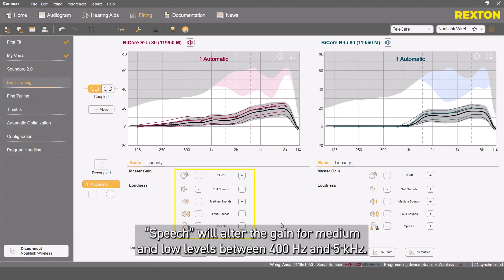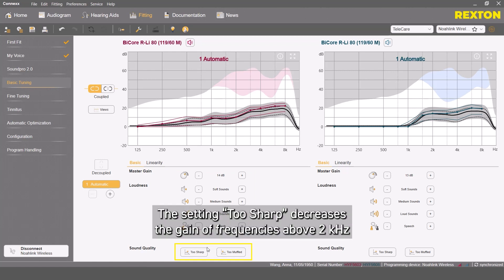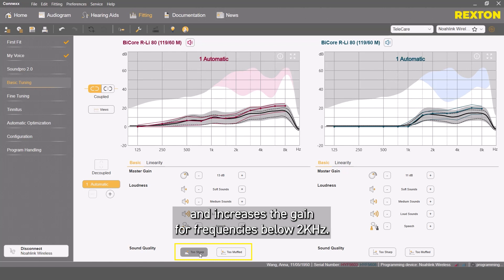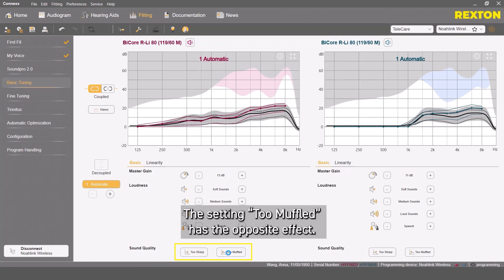Speech will alter the gain for medium and low levels between 400 Hz and 5 kHz. The setting 'too sharp' decreases the gain of frequencies above 2 kHz and increases the gain for frequencies below 2 kHz. The setting 'too muffled' has the opposite effect.